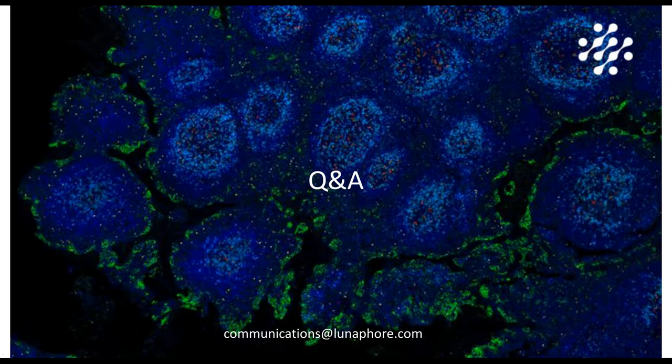Well, with the dynamic incubation technique, we could already reach good homogeneity levels, but of course it's something we seek to continuously improve. So now we are looking to different ways of increasing homogeneity in the chamber rather than flow-related techniques.